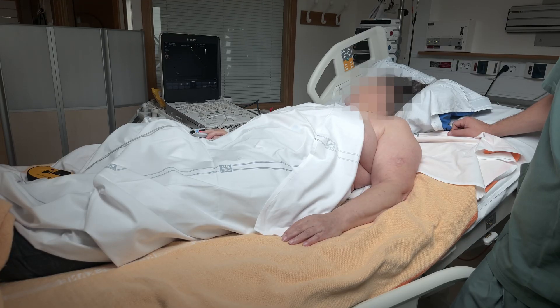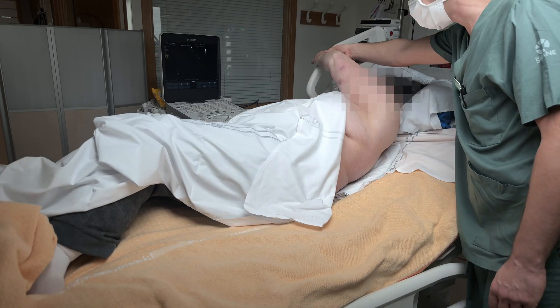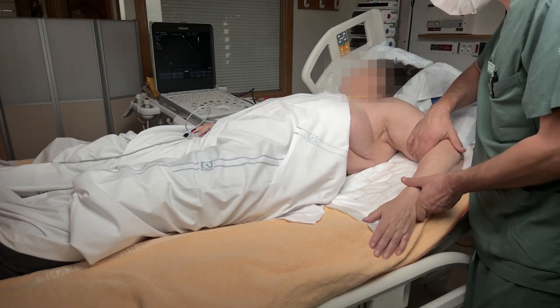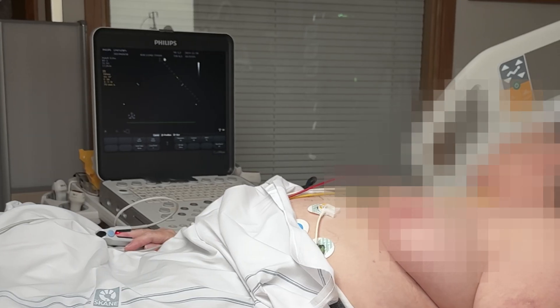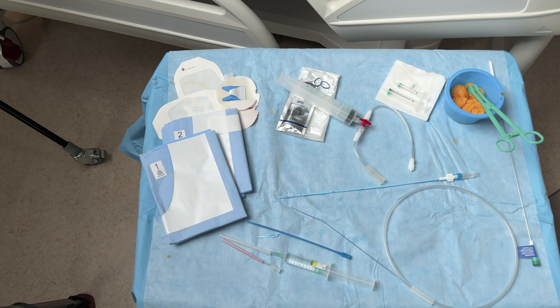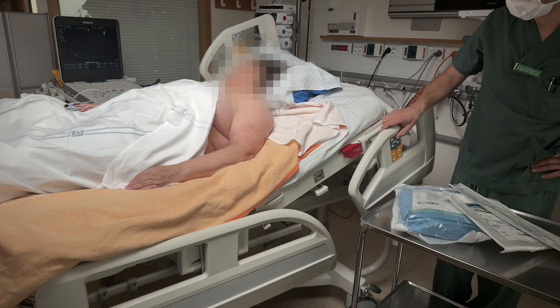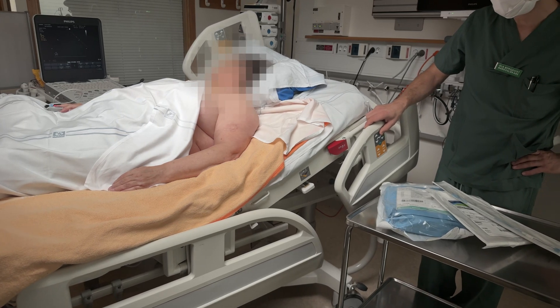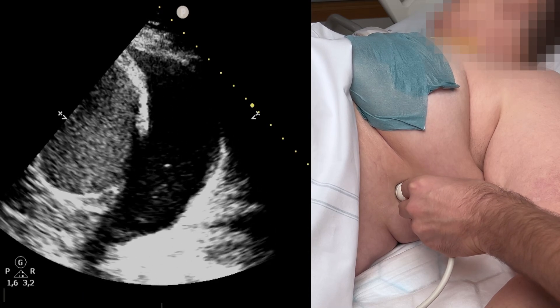So here's how you place the drain. Move the patient's arm away from the field, either by stretching it over to the contralateral side or by retracting it backwards. Foiled drape can be used to retract a large abdomen or, as in this case, a large bosom. Place the ultrasound machine on the contralateral side of the bed, have your equipment within reach for your dominant hand, and raise the gurney to a suitable level. Good ergonomics is key for good results. A pre-scan before prepping confirms pleural effusion and locates the optimal puncture site.